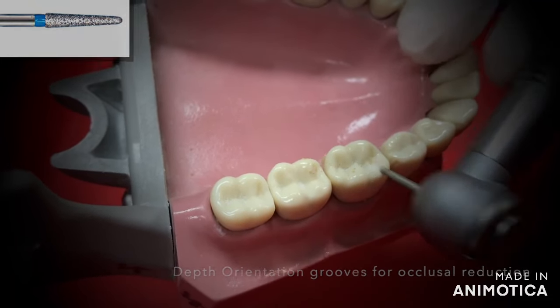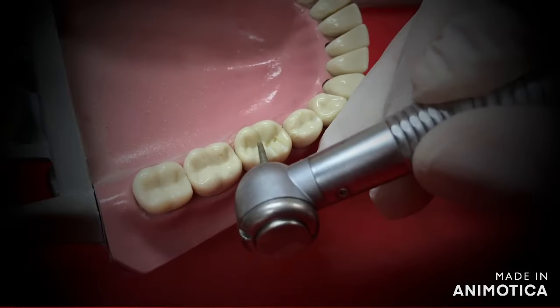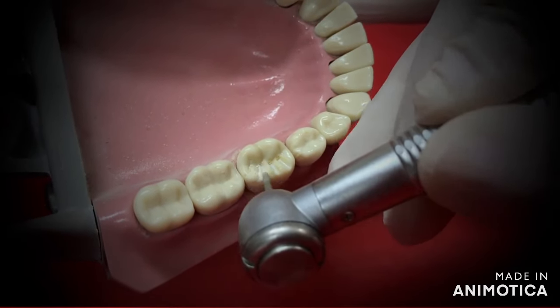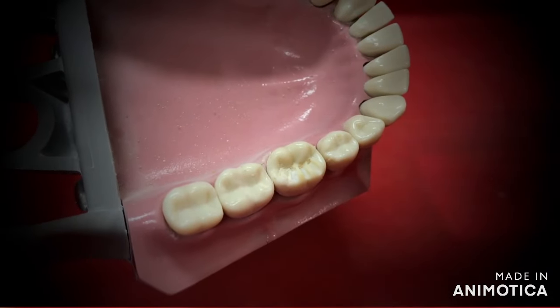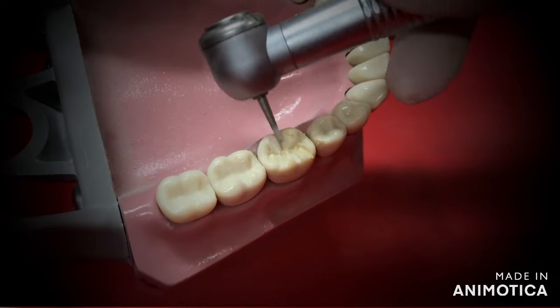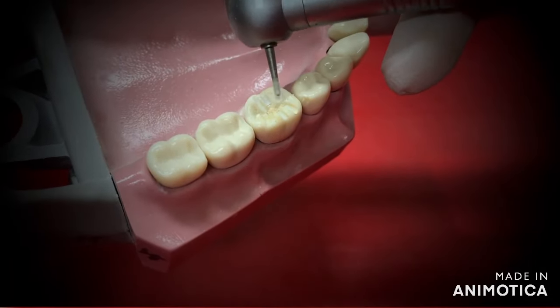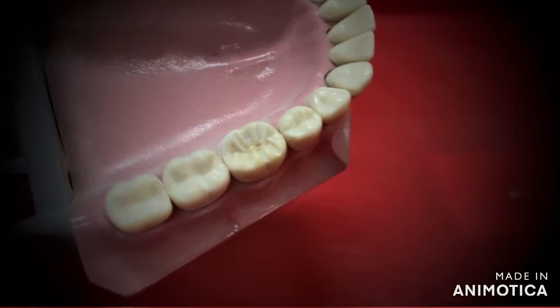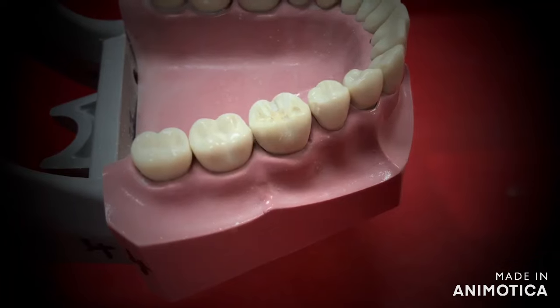The first thing to do is start with the occlusal reduction. I've used a tapered round TR-13 burr for this. You can start by making depth orientation grooves on the occlusal surface — all you have to do is sink the burr in completely on three different points: the mesiobuccal cusperage, the buccal or lingual groove in the center, and the distobuccal cusperage. Make sure the burr is oriented along the original incline of the tooth while doing this. The same is followed on the lingual occlusal surface as well.